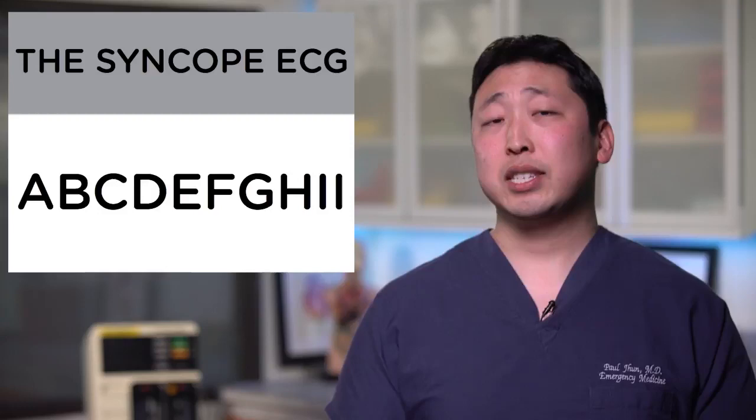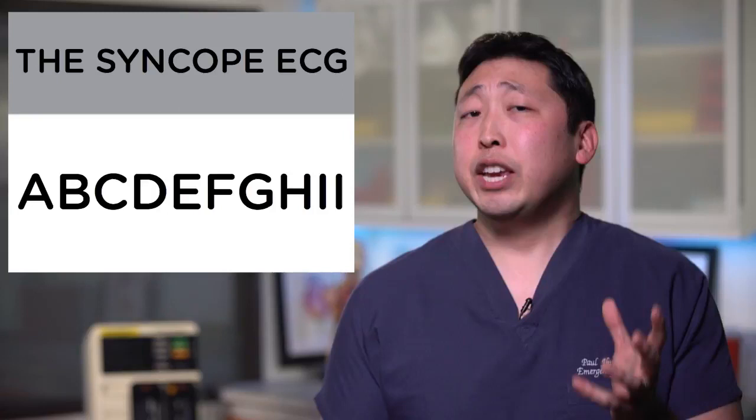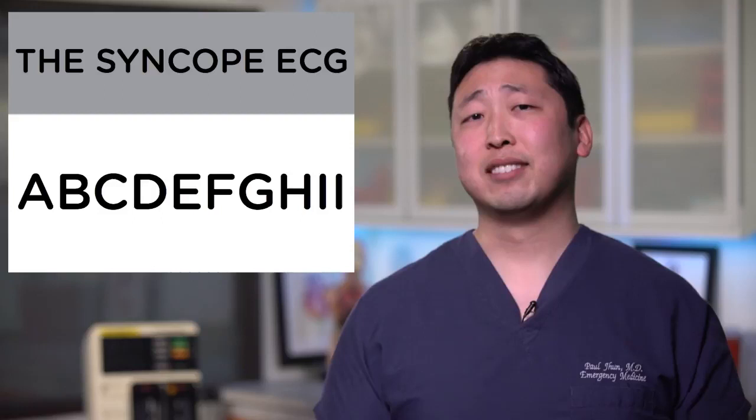There's no classic ECG finding for this. However, it's a reminder for us to go back to the patient and carefully listen to the heart to see if we can hear the classic crescendo-decrescendo systolic murmur that you find in critical AS. Take a listen.